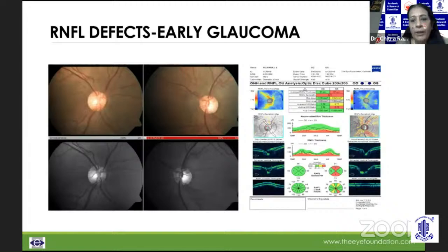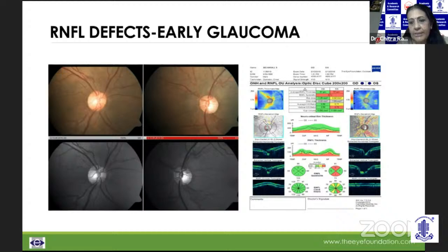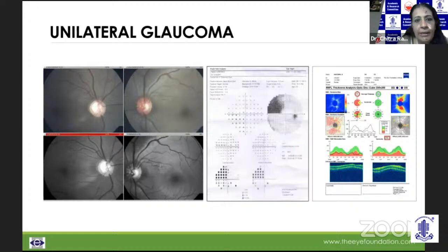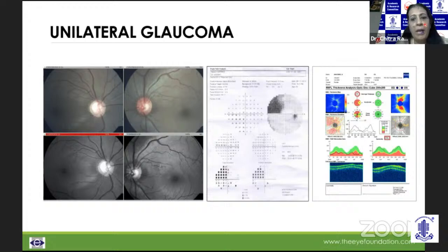If you look at this, this is an early glaucoma with a typical inferior RNFL defect in red-free light, and the OCT confirms an inferior RNFL defect — that corroborates the story. This is again a case of unilateral glaucoma with that RNFL defect seen inferiorly, and that superior field effect which tells us we are looking at glaucoma.